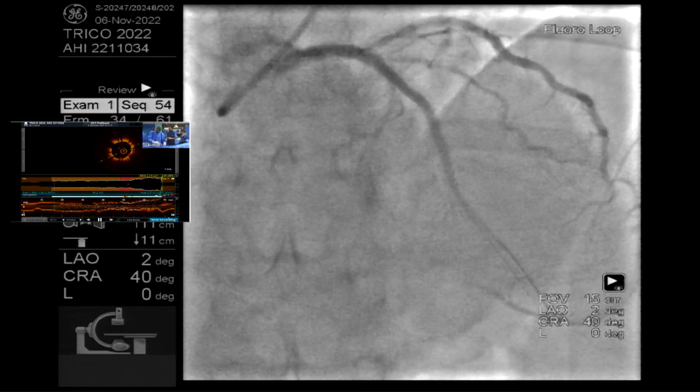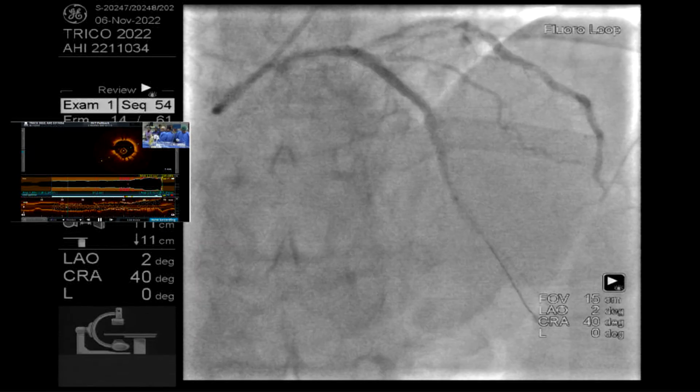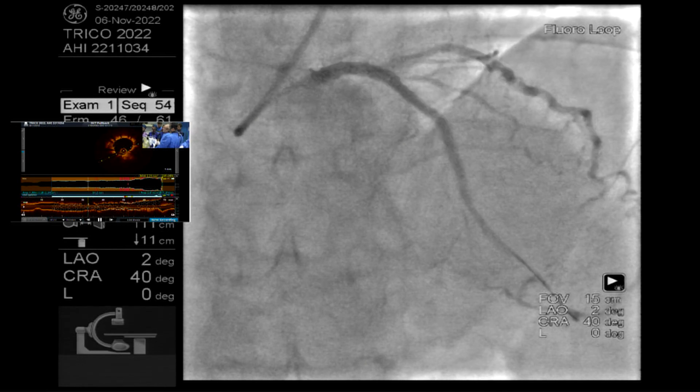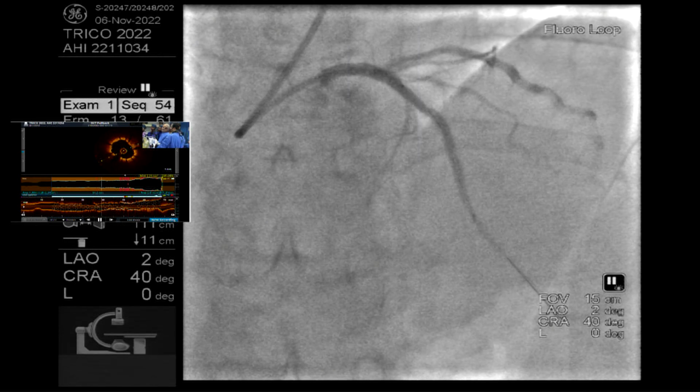Look at this. From the distal to the proximal now. The position is very good and very circular. Very good, it looks way better than even the angiogram looks. Lots of calcium behind the stent strut. Here is a very eccentric mixed plaque, but the opening is okay and the normal site is okay. This is the overlap now. See, it looks much more circular than what I expected. Yes, and I think IVL makes that happen a lot.